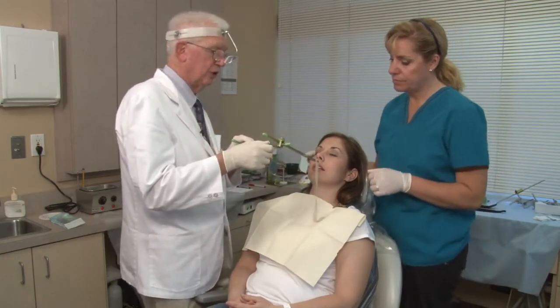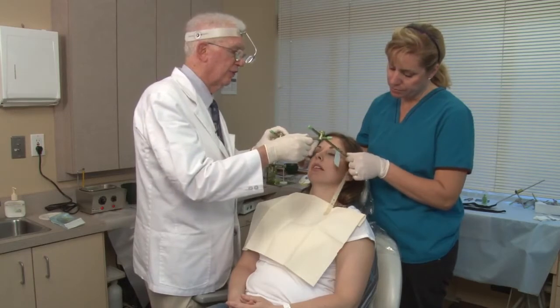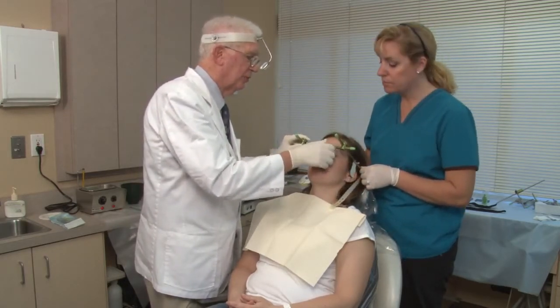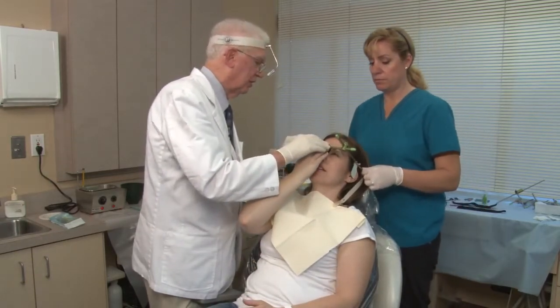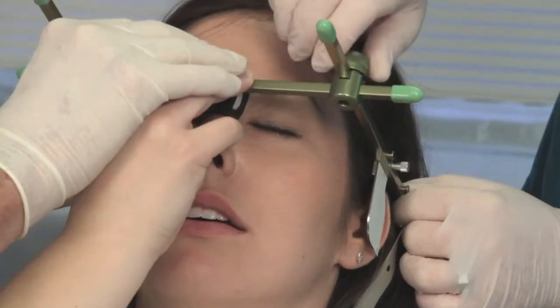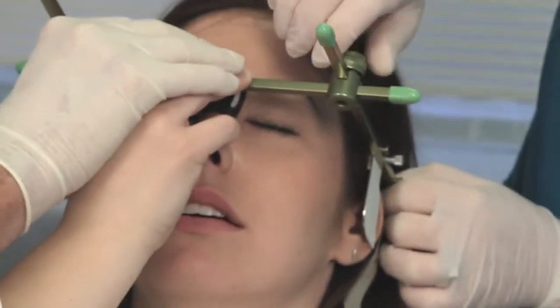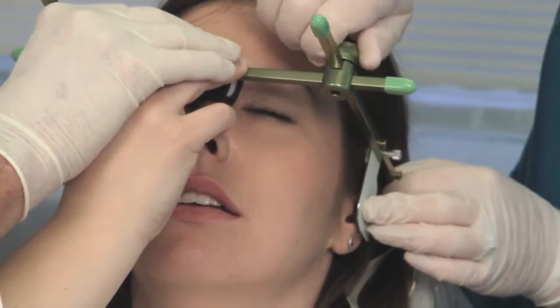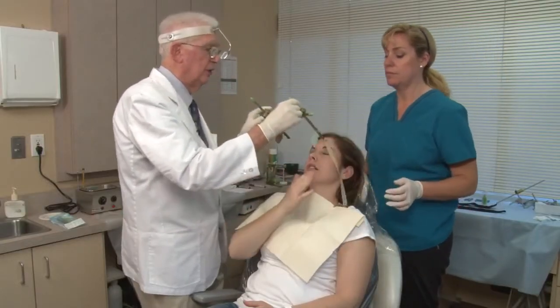And so Christy and I are going to set the side arms first, or the flag assembly. We're going to put it against Nasion, and I'm going to ask the patient to reach up and hold that firmly back against your face. We're going to take the flag assembly and move it forward so that it covers the tragus of the ear, and then lock it firmly. Okay, now let go, Allison.